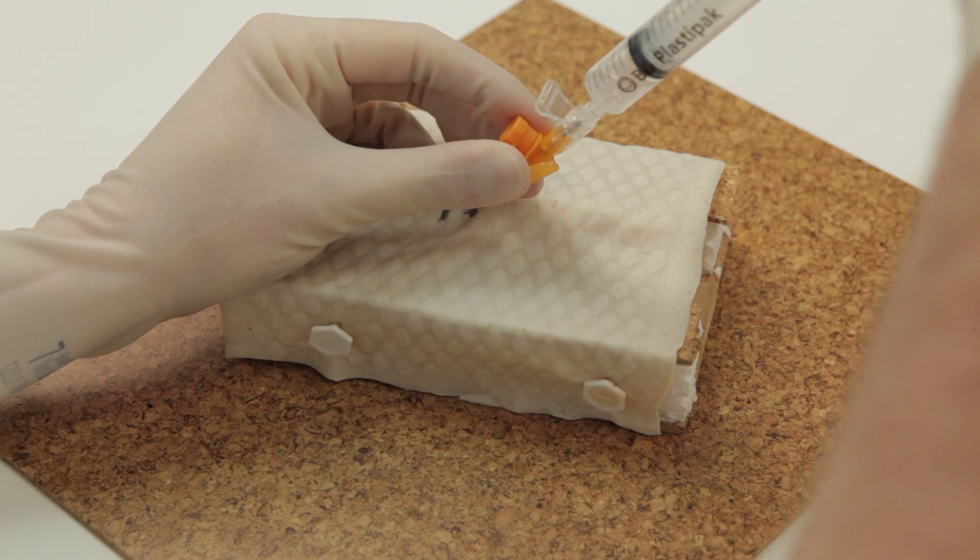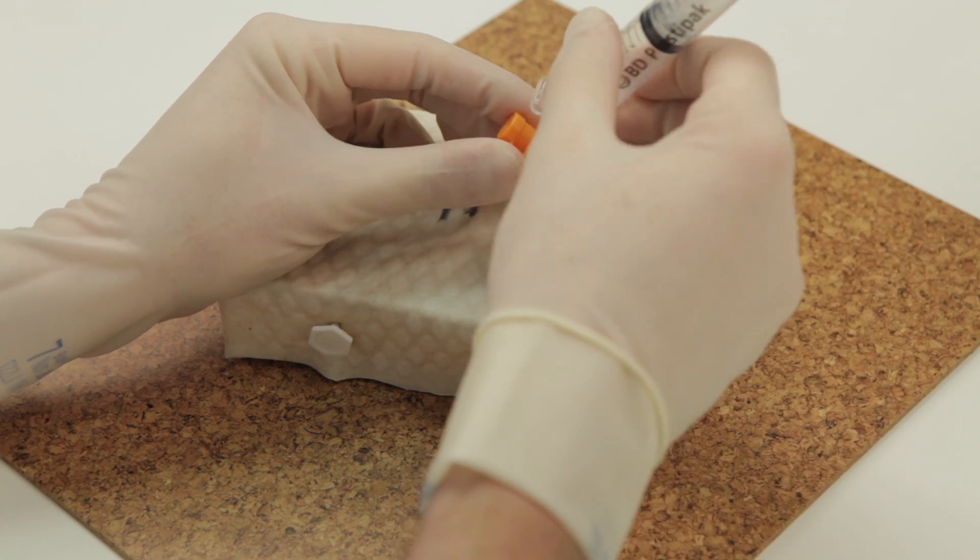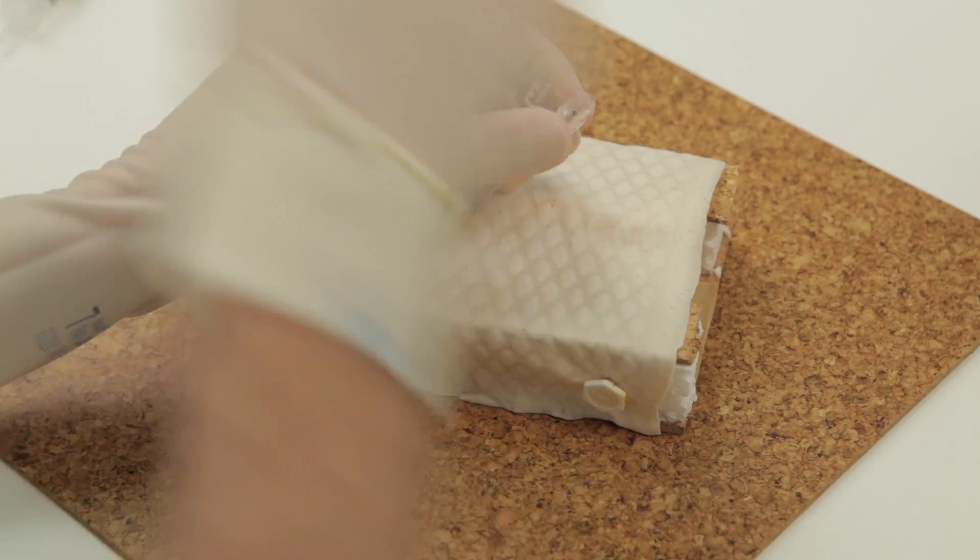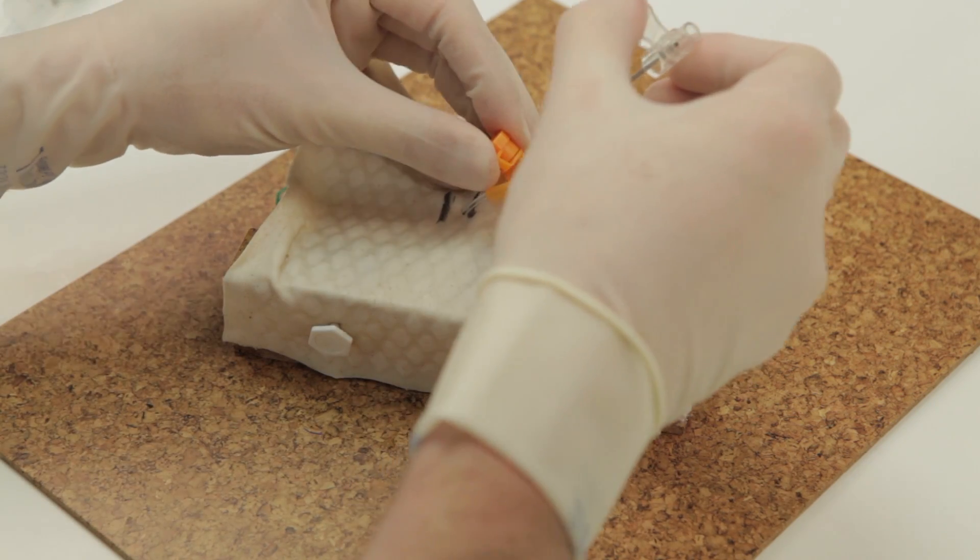Free aspiration of air confirms entry into the trachea. The cannula can then be slid into place.